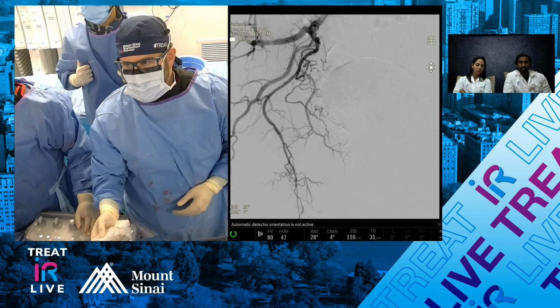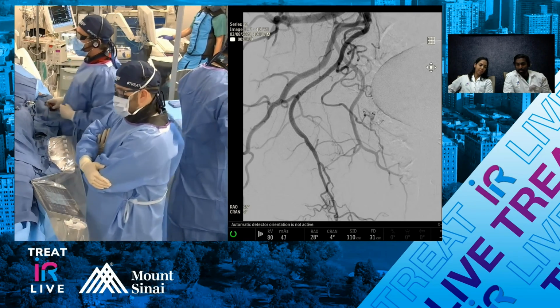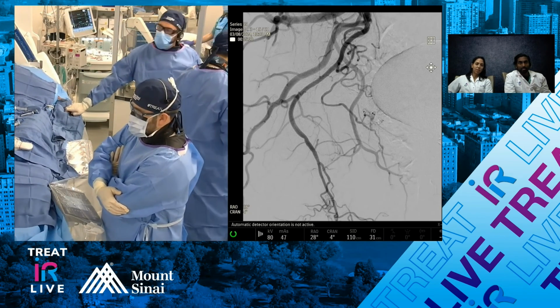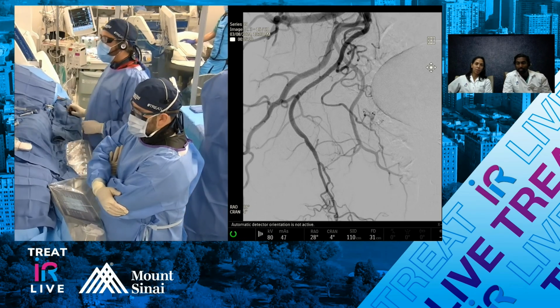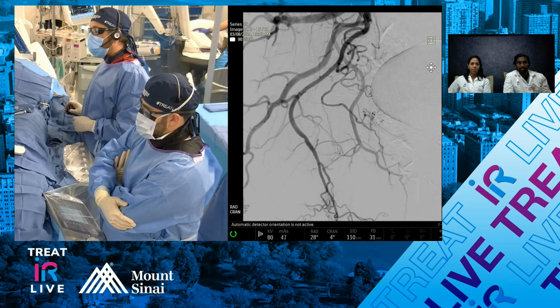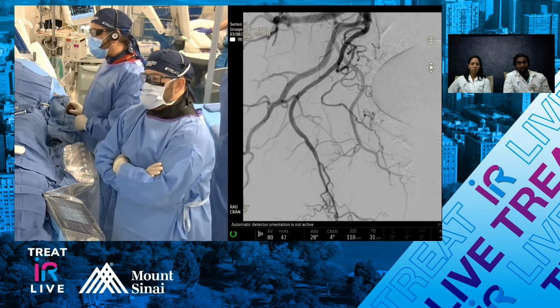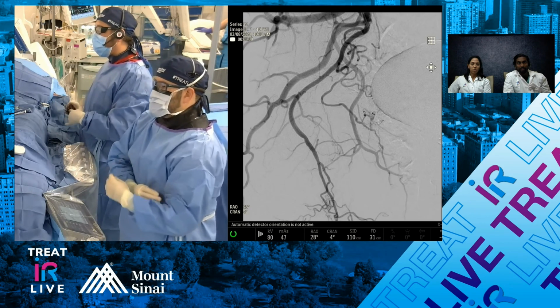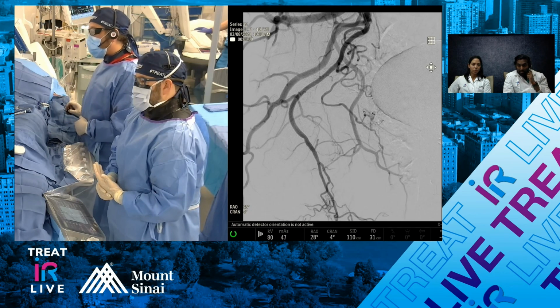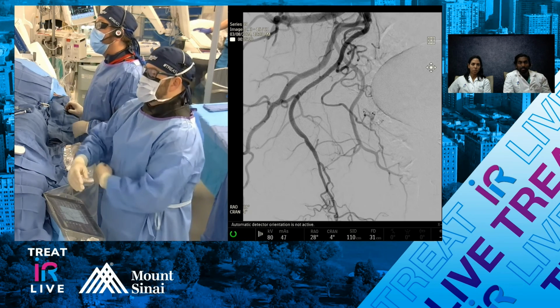Yeah, it's rectal. Are there any burning questions, anything on the chat that you think we should really try to address? Getting catheters stuck, but I think with the thin dilution, that's not really a concern. Yeah, I haven't had that be an issue. What's more common with the thin dilution is that the glue actually travels too far up because it's so loose, and so you could theoretically get, if you're not careful, a lot of reflux, and it doesn't necessarily solidify until it's close to the base catheter, and then that's where you've got to be careful because you don't want glue in your base catheter, obviously.